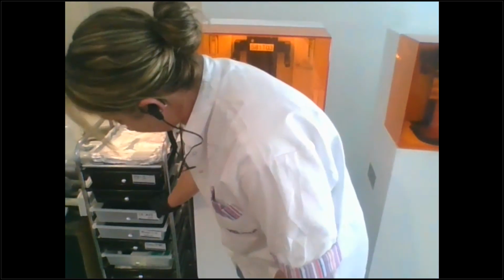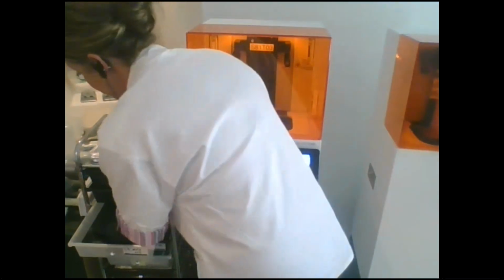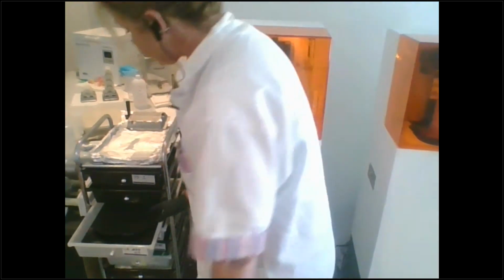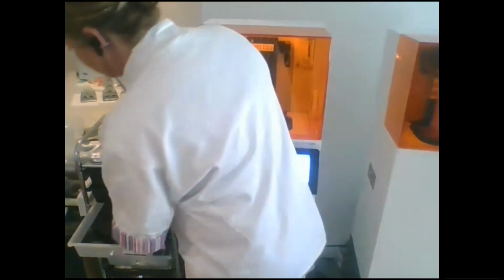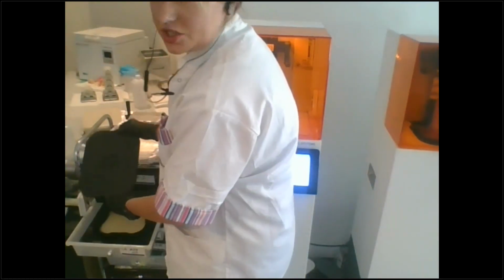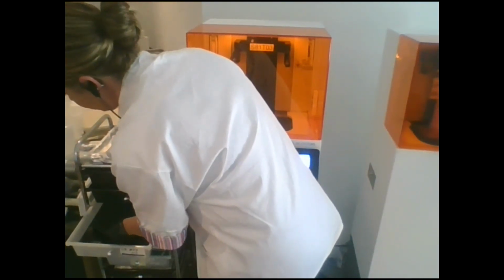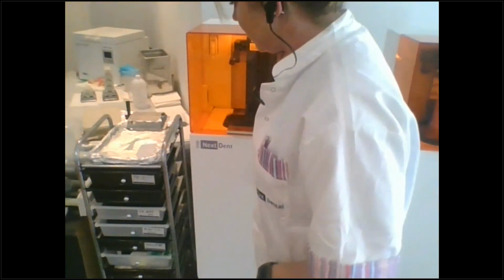And every day when I have CNB MFH, which if you closed your lab, you probably cleaned out your resin trays. But every day you want to stir your CNB MFH if you're not using it. That's the only material you need to stir every day or every couple days. So it's easy to identify. And I can just open up the lid. I have them in my garages. And I can just use my stir and I stir. So that's just a little tidbit of what you can do. This little cart was only like $20 or $15 at Walmart, I think.